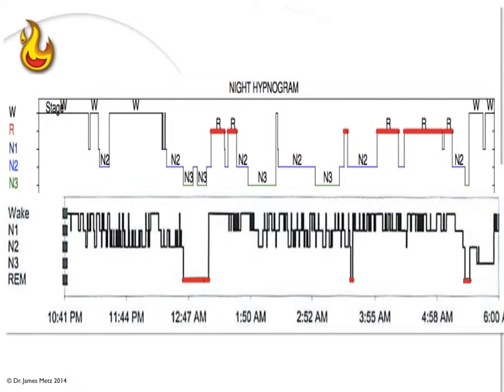Let's talk about the graph below it. You'll see multiple awakenings during the night, and you'll notice that there's no delta or slow wave sleep. It's a little bit different. The REM's at the bottom here instead of being at the top, but you'll notice the awakenings are pretty significant, and the person is awake all night long, and they'll usually report to you that they're dreaming all night long. So when somebody's dreaming all night long, that's a bad thing.